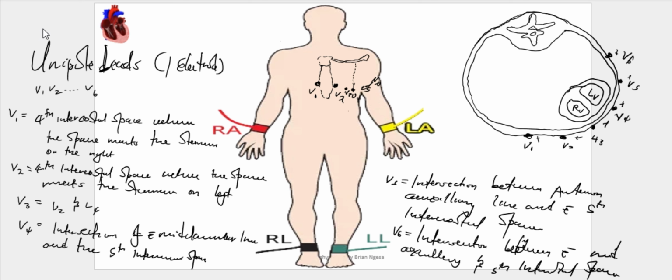And it is from that they are likely to create some electromagnetic or electrical field as far as the heart is concerned. For example, when you're having a negative electrode over here and a positive electrode, so just ignoring whether it's the wave of depolarization or repolarization, ideally in electrical fields we normally have electrons moving from the negative to the positive.